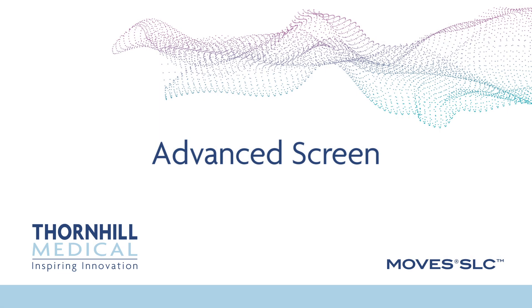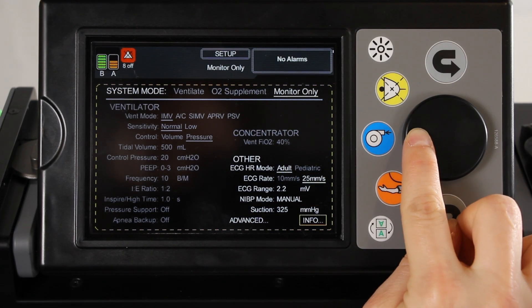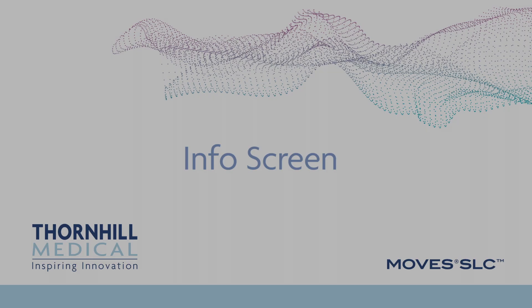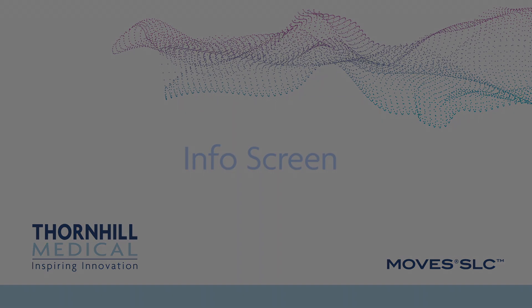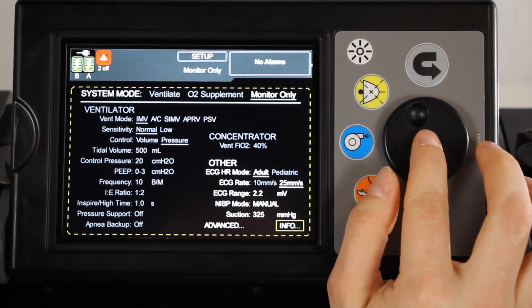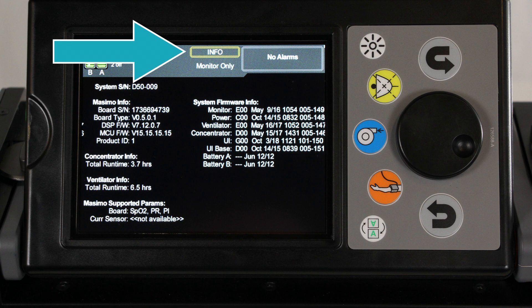The Advanced screen is accessed from the Setup screen. This screen allows the operator to make more advanced modifications to the patient monitoring settings. The Info screen is accessed from the Setup screen. This screen allows the operator to view information regarding the specific MOVES SLC device being used, including serial number, concentrator and ventilator runtimes, firmware versions, and Massimo information.